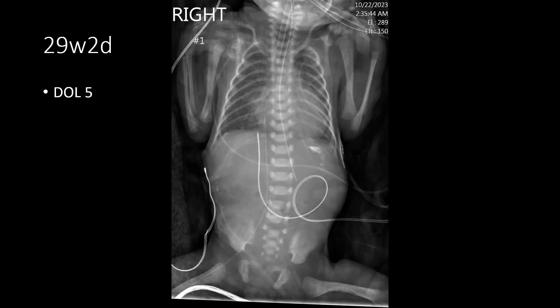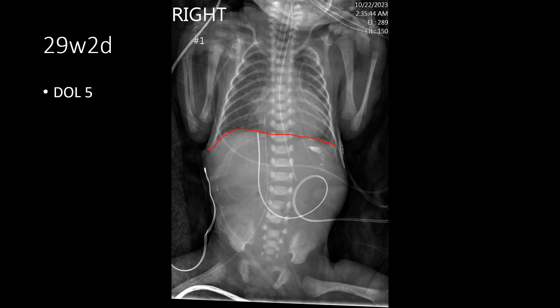Here we have another case — a very premature infant, 29 weeks, now on day of life five. They want to replace the umbilical venous catheter, which is appropriately positioned. As the infant matures and they want more long-term central venous access, they placed a catheter from the right lower extremity coursing up through the common iliac vein, IVC, and into the atrium. The terminus of the catheter is a little high in the right atrium; ideally you want that PICC right at the inferior cavoatrial junction.